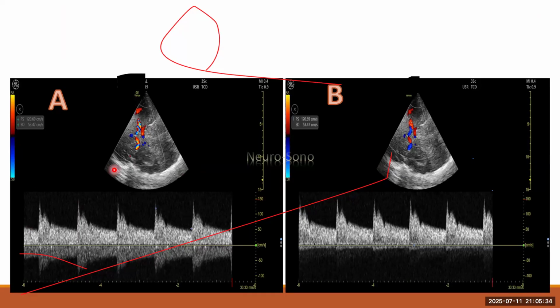So it is in the same image. There is A, a bifurcation insonation at somewhere between the depth of 5 to 6 centimeters. This is an MCA and the ACA in the same trace, whereas this is an MCA with possibly a middle cerebral vein here.